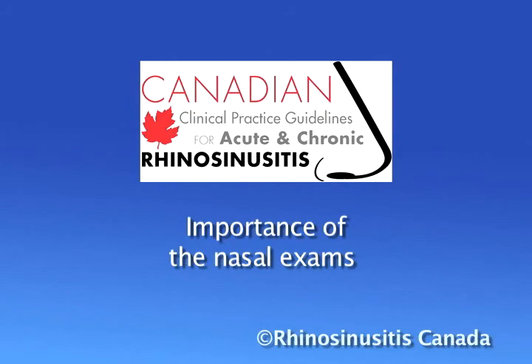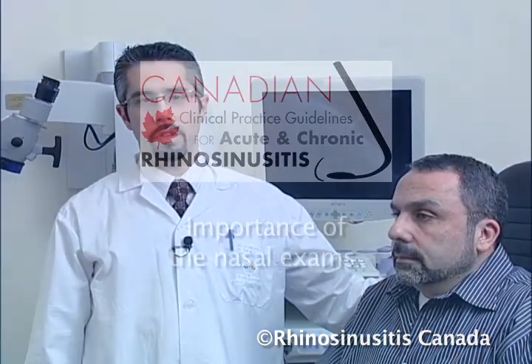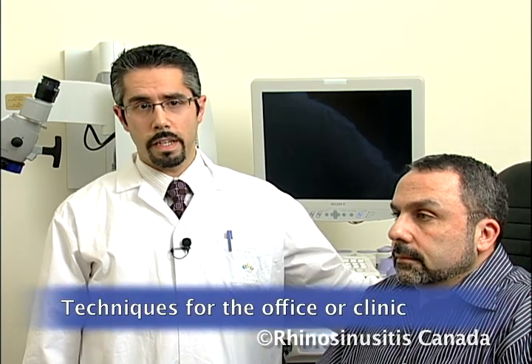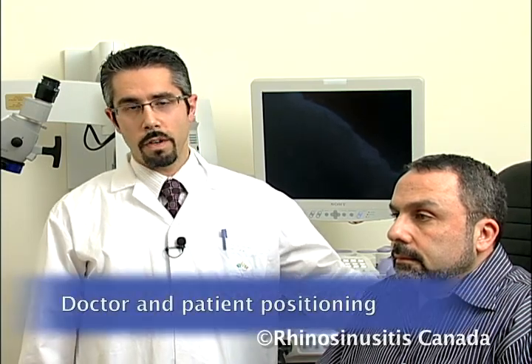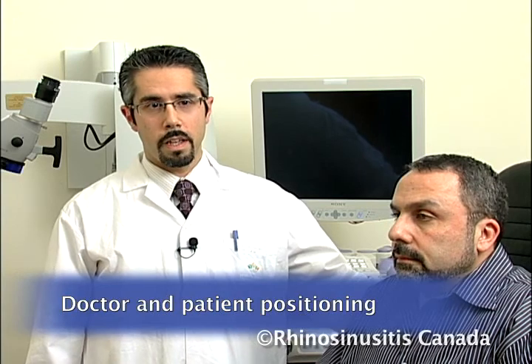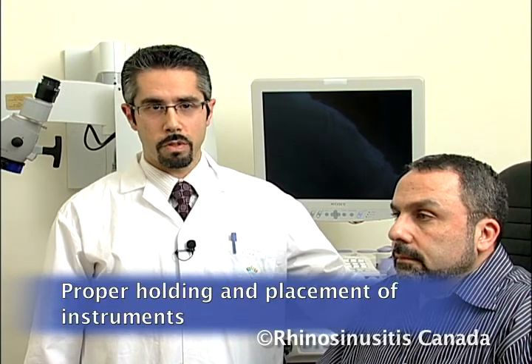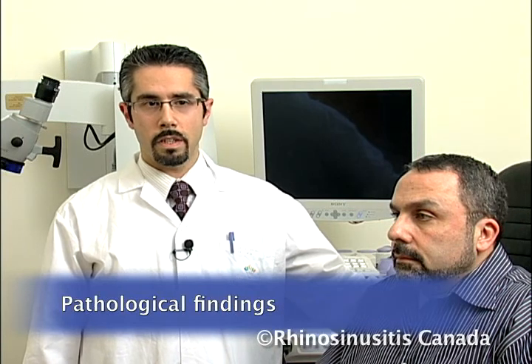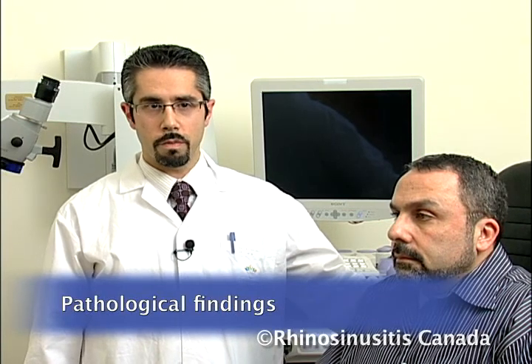In this short instructional video, we will illustrate and describe effective techniques to examine the nose that you as a medical practitioner can use easily in the office or clinic when seeing patients with sinonasal complaints. We will cover doctor and patient positioning, proper holding and placement of instruments, anatomical structures to examine, as well as common pathological findings to look out for.